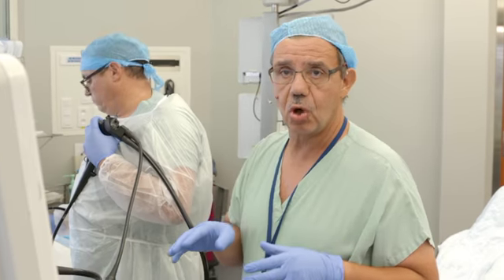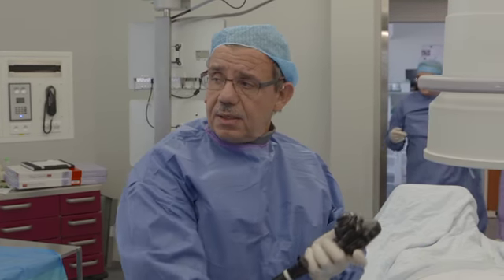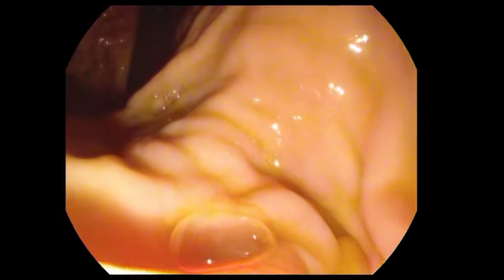Okay, now we change the scope and we come back for the ERCP. I introduce now the duodenoscope, and I will go quickly into the duodenum. I use also the CO2 insufflation, and now for all therapeutic procedures we use CO2. Okay, there is some liquid. I aspirate the liquid, and I will try to find the pylorus here. Now I push and down with the scope, and now I straighten my scope to be in front of the papilla. And you see that this lesion is an infiltrative lesion.